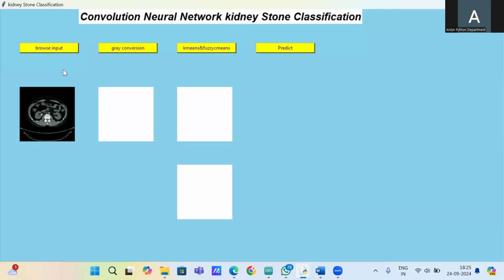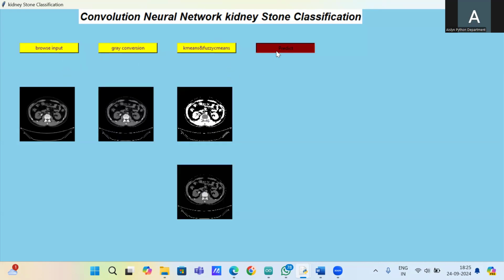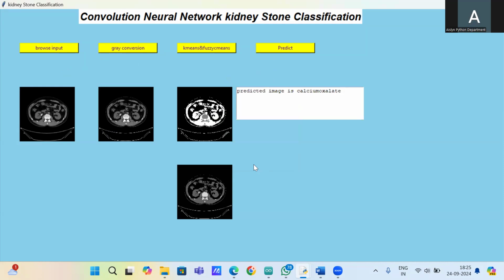Yeah. Now I'm doing the color conversion. After that, K-means and fuzzy C-means. And finally, you can see that our predicted image is calcium oxalate.